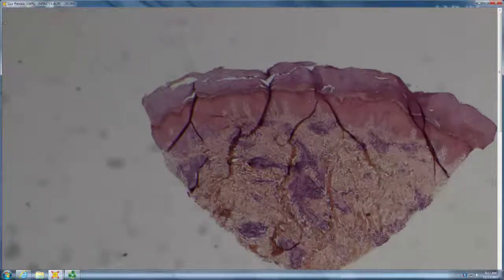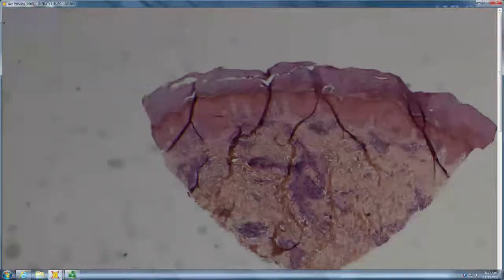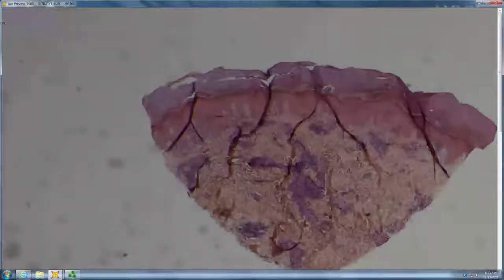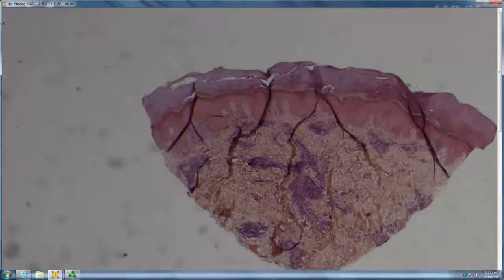I think perivascular infiltrate. I see some EOs definitely around, and you're starting to get some stuff on the collagen. You mean like karyorrhexis or like degranulating eosinophils? Like degranulating EOs. So it's like an early Wells. So we've seen the whole spectrum of Wells pretty much. How are we doing time-wise? We're still good.